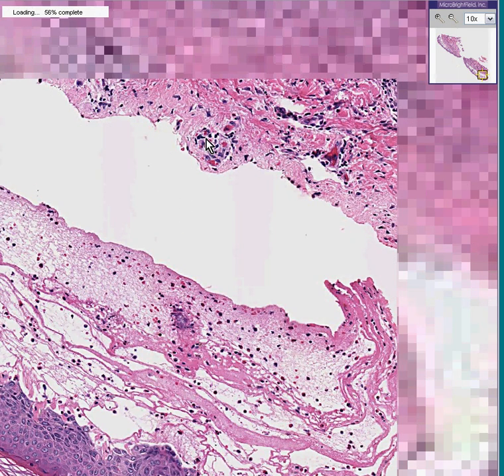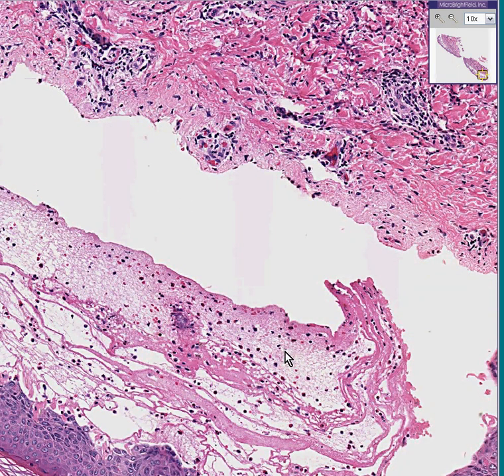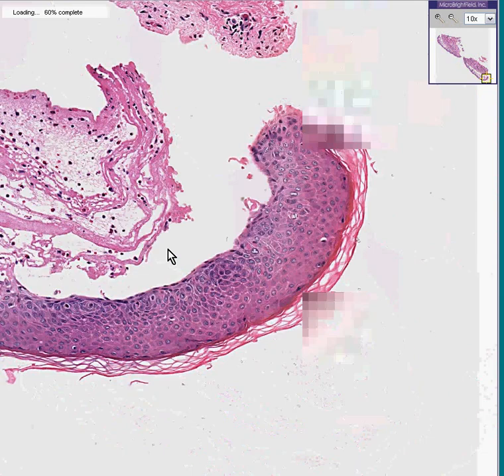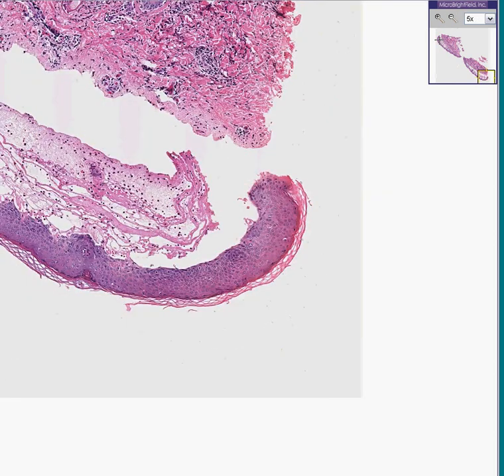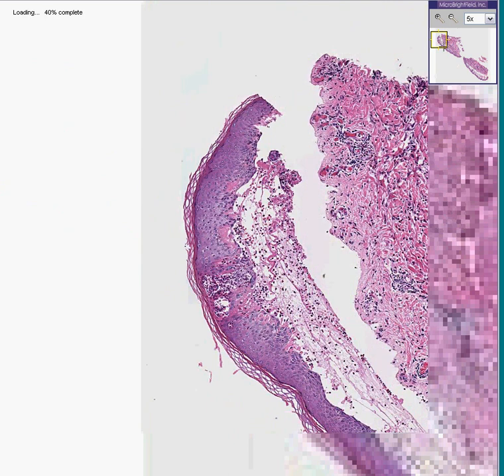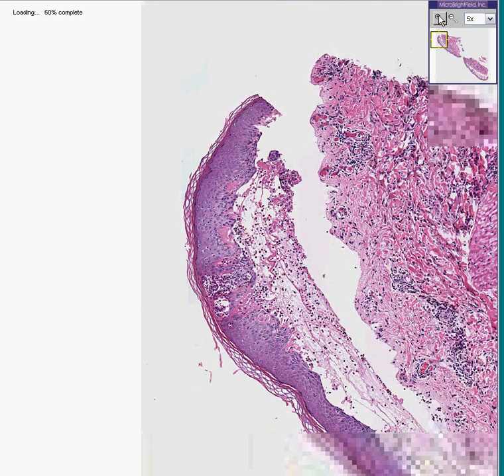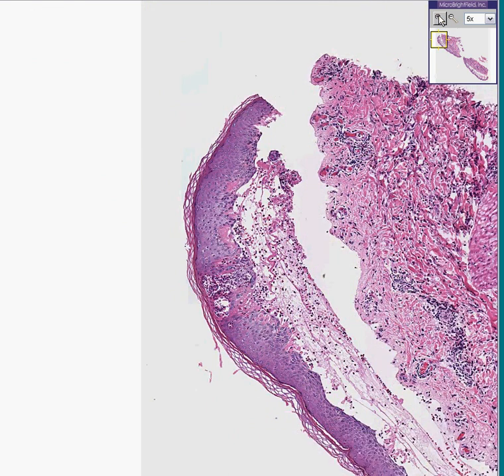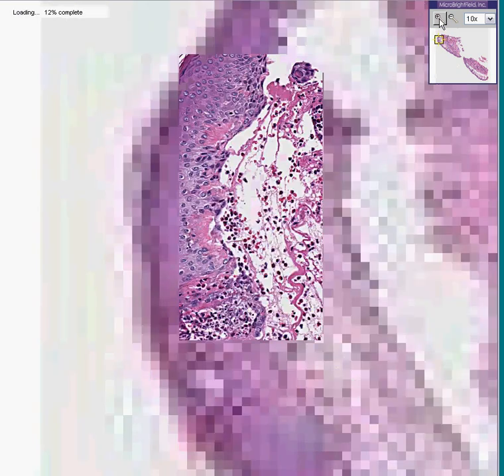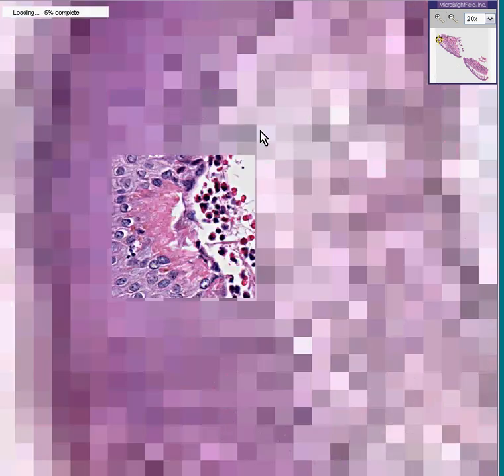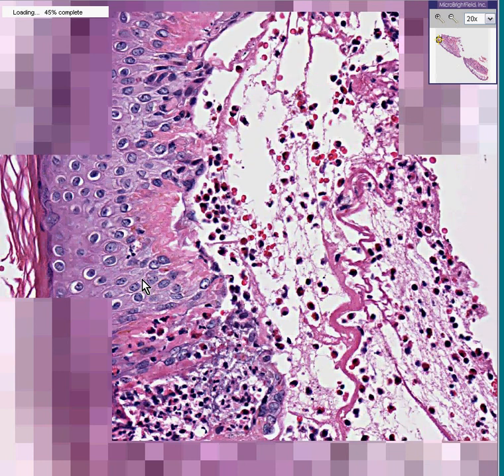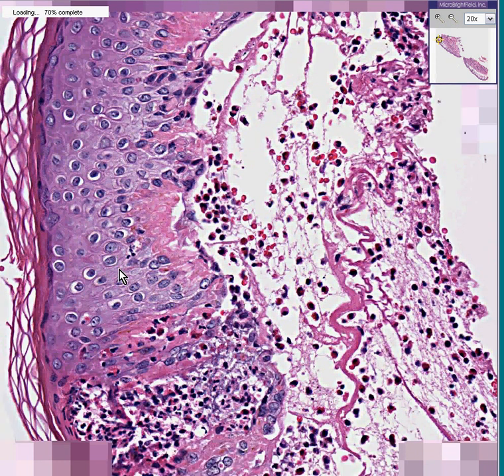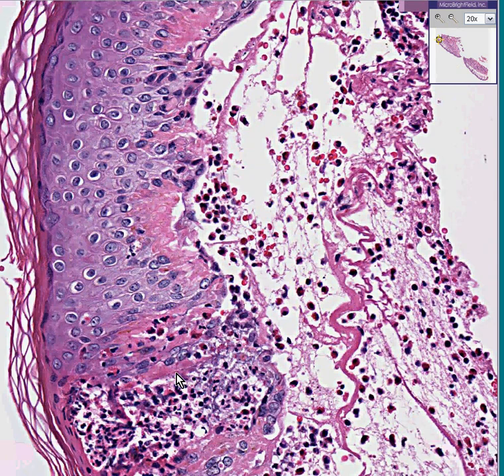I don't see too many Tzanck cells here — maybe there aren't any, maybe I'm just impatient. Let me take another quick look somewhere else. I don't want to take your time up too much. Let's see if we could find some intranuclear reddish inclusions, other than the normal nucleolus that you see inside of cells. Here's an area where there's a little secondary abscess within the epidermis.